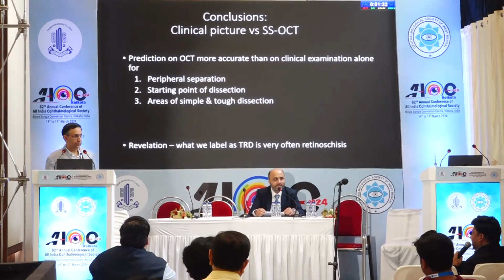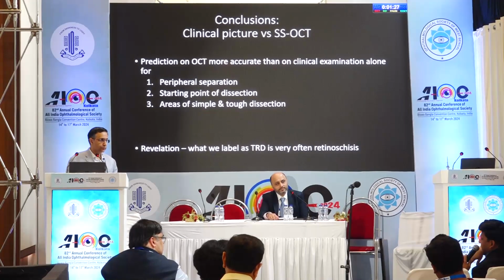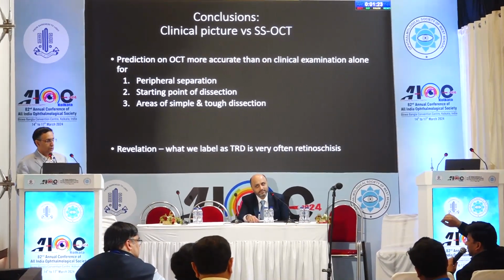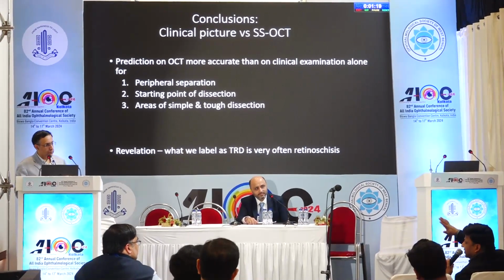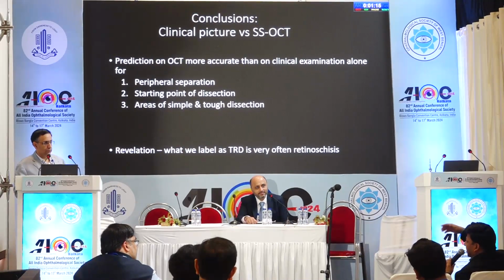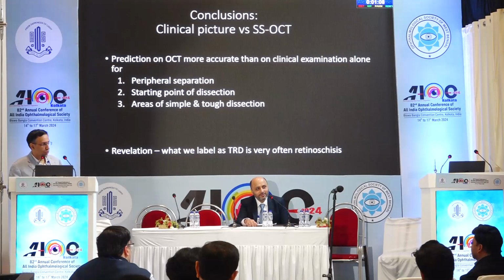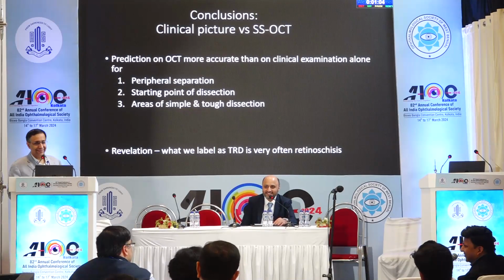One more sign I would like to highlight about the vitreous cases is once you have dissected all the membranes and you feel your vitrectomy is done, but there are small streak-like hemorrhages in the peripheral retina, it means that your vitreous is still present over there. It's still not gone, so you have to explore that. In that case, you can put some triamcinolone to identify that residual vitreous. They are popularly known as the red flag sign.